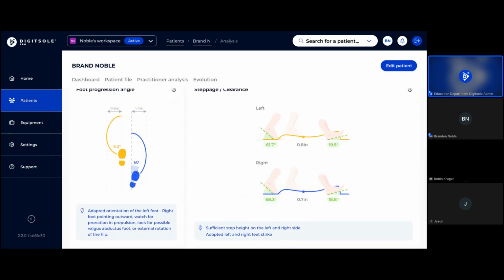So sometimes that can be a strategy that people will use if they can't really dorsiflex at the ankle, flex at the knee, or they have excessive external rotation at the hip, or like I said, that's their strategy. But at the least, it's very asymmetrical, right? We're looking at a 10-degree difference between the right and the left. And so I would want to further look at that and say, is it a problem? And which side is it? Again, it could be a strategy because of an ankle or a knee problem, potentially a hip problem, or it's got really tight external rotators on that side.